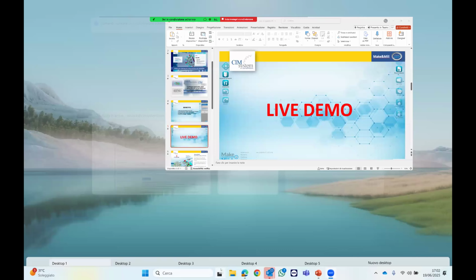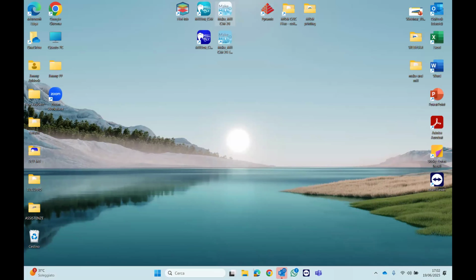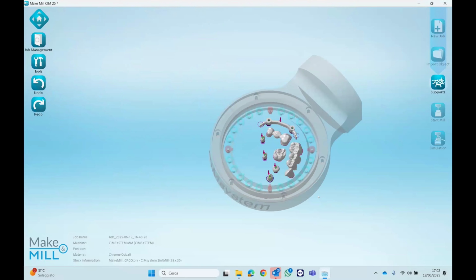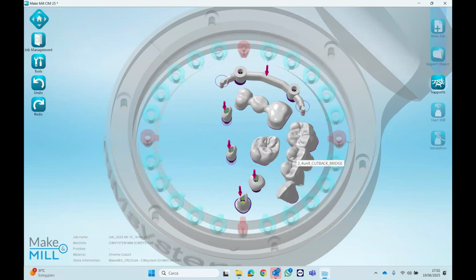Okay, let me go back here. Let's start here. Well, we can do it from this one here. It's not a problem. Okay, I'll go back to this one here. We continue on this one right here. No, one more thing that I didn't do.